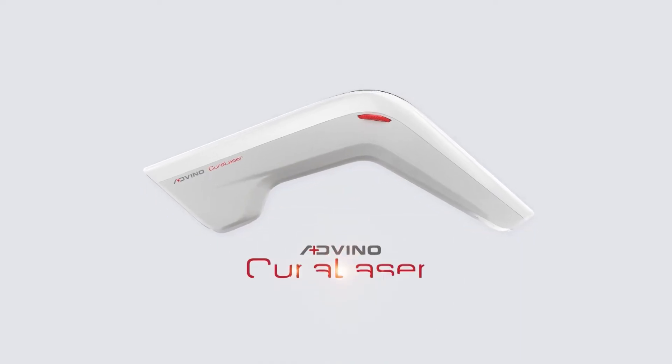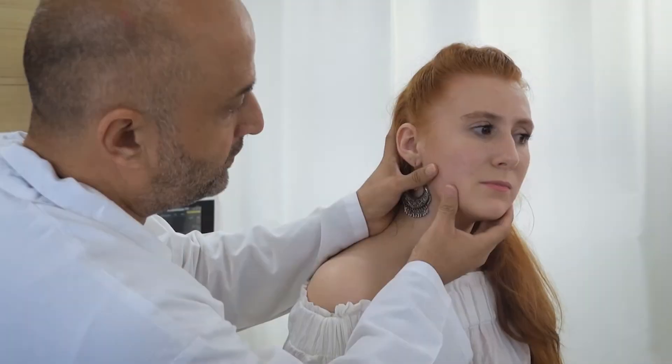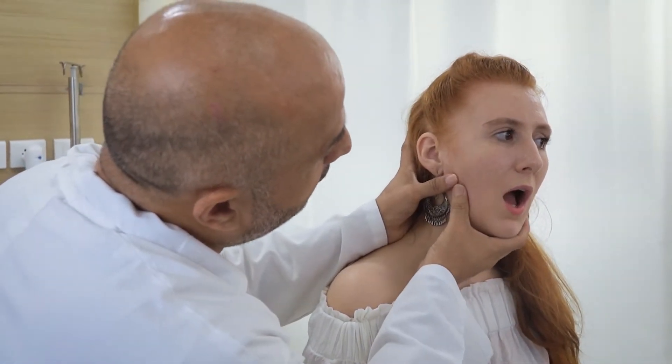This video demonstrates the use of Advino CuraLaser in temporomandibular joint. Assess the jaw for swelling, inflammation, and muscle spasm before starting the treatment.